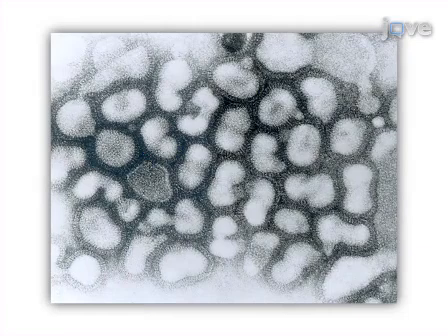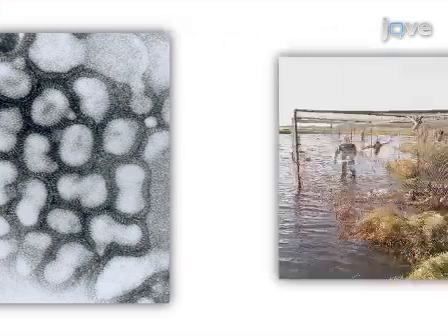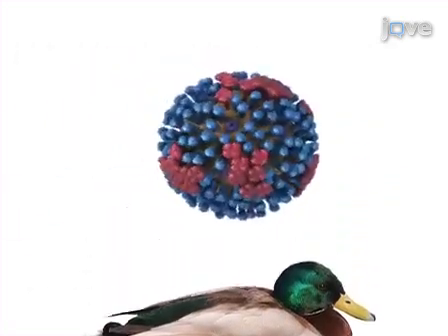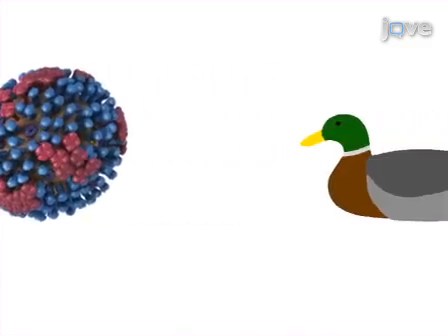Human pandemics of flu, including the recent swine flu epidemic, originally stem from the avian influenza virus, AIV, which is a species of the influenza A virus. Large surveillance programs have been implemented to collect information on the ecology of AIV and to detect highly pathogenic strains. In this video, a method is presented for isolating and identifying AIV samples from wild birds.